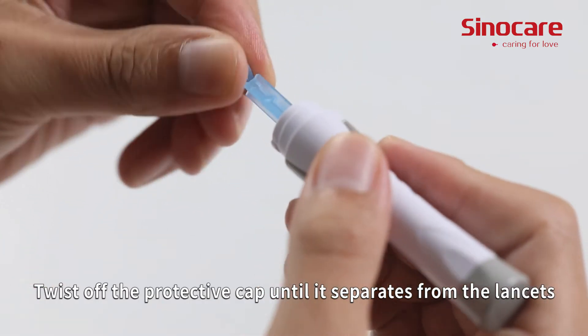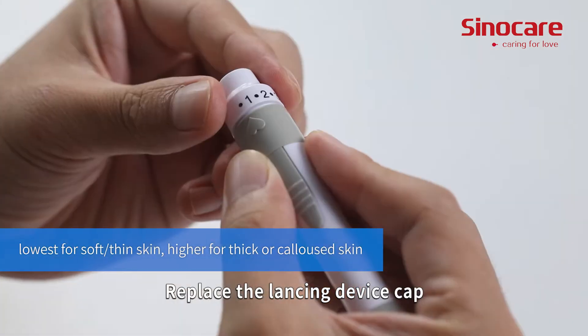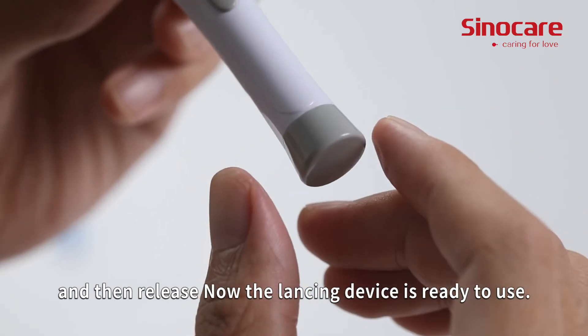Twist off the protective cap until it separates from the lancet. Replace the lancing device cap and set the puncture depth to the desired number. Pull back the cocking control until it makes a click and then release.